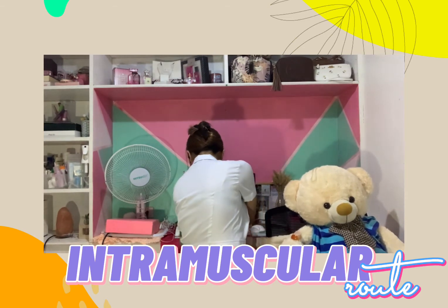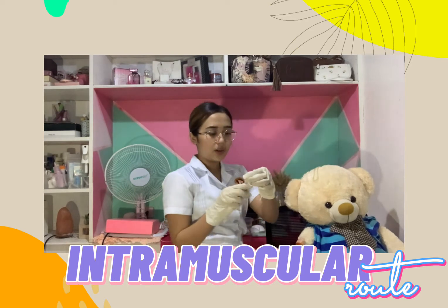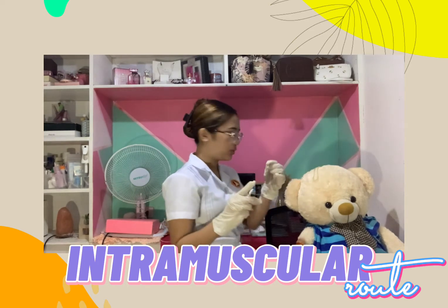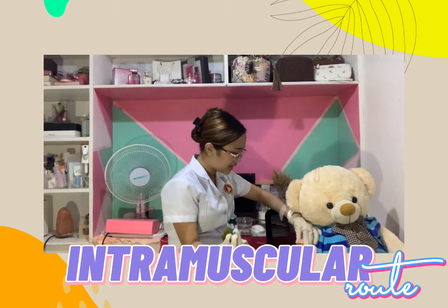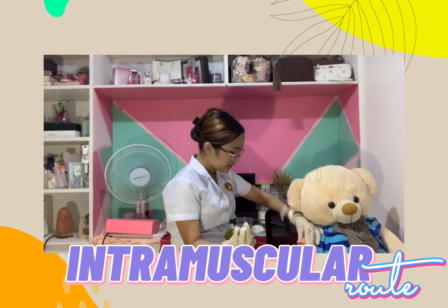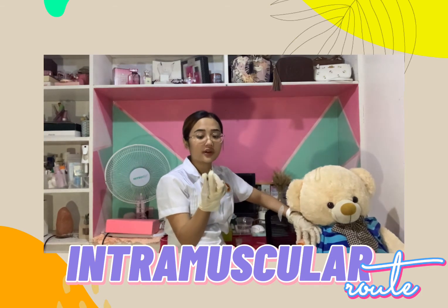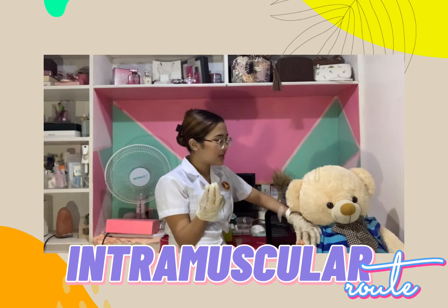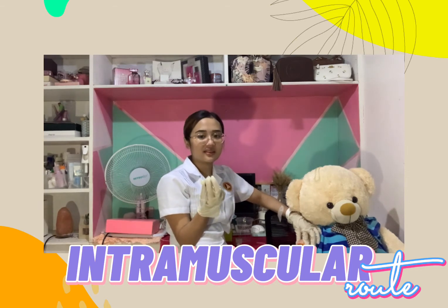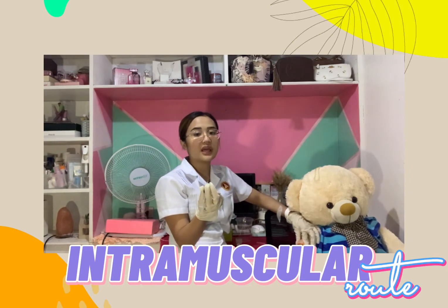And now, we will get the syringe. We will remove the cap in a straight pull. We will perform the Z-track motion, or we will spread the skin of the patient with the use of our non-dominant hand. We will hold the syringe with our dominant hand with the thumb and forefinger. And then, we will pierce the skin of the patient at 90 degrees. So, when the syringe is already inserted, we will aspirate the plunger.